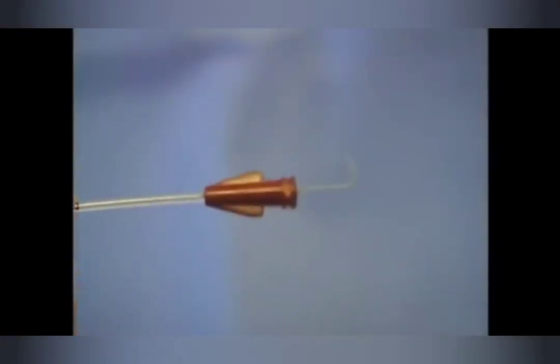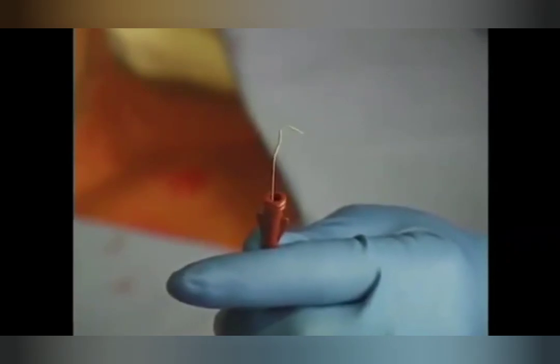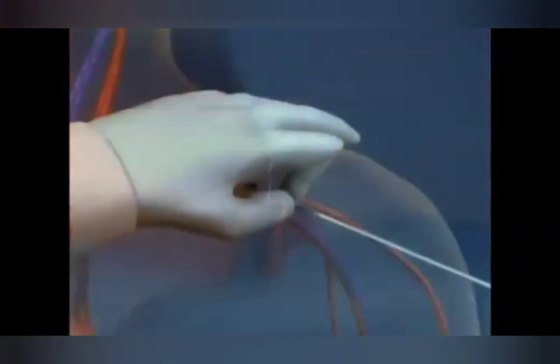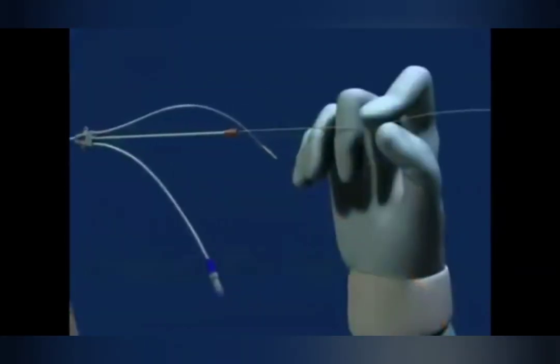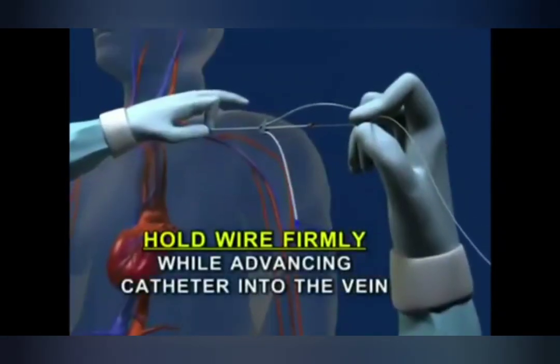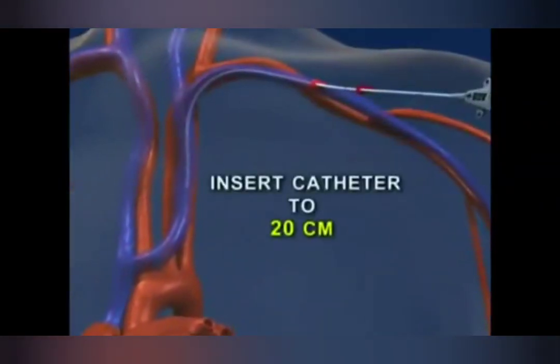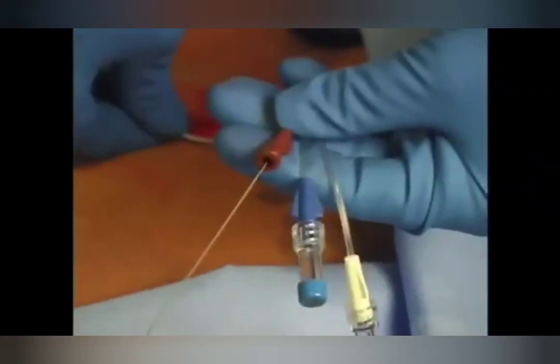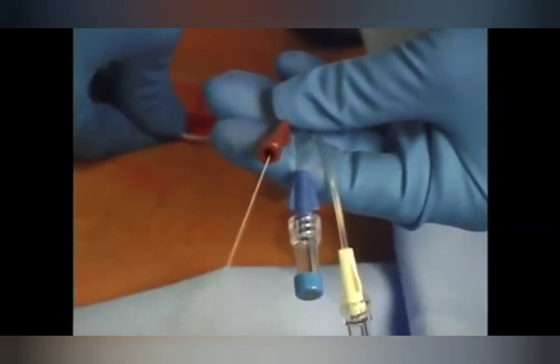It is extremely important that the wire be advanced all the way out of the catheter until it exits from the brown hub before beginning to advance the catheter into the vein. It is absolutely necessary that the wire be held firmly while the catheter is advanced to prevent the wire from being lost in the vein. Once the catheter has been inserted to 20 centimeters, the wire is removed. The catheter can then be positioned at the appropriate depth.